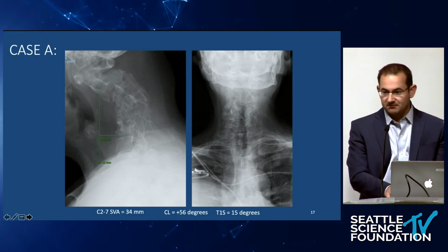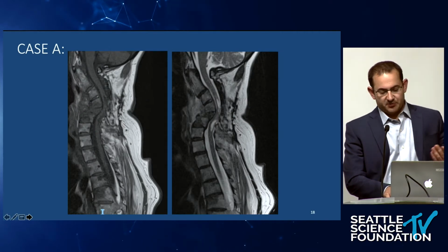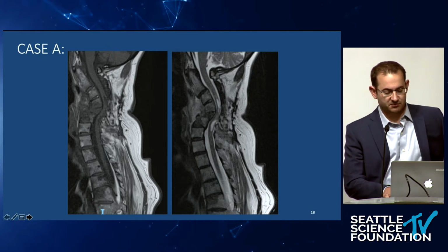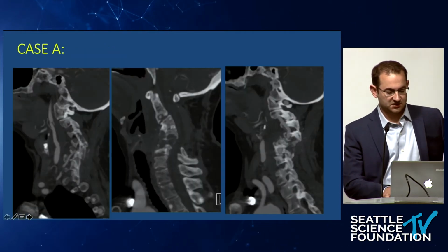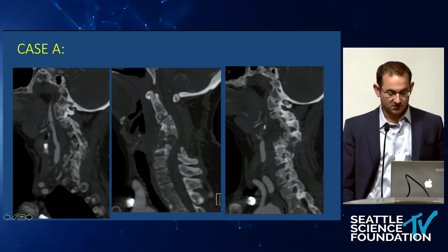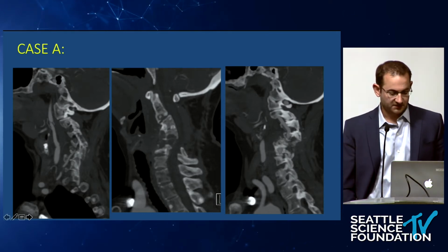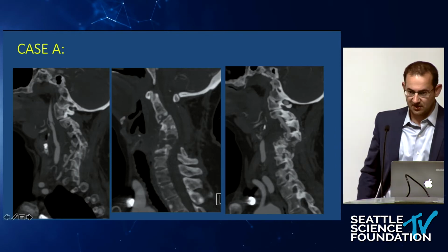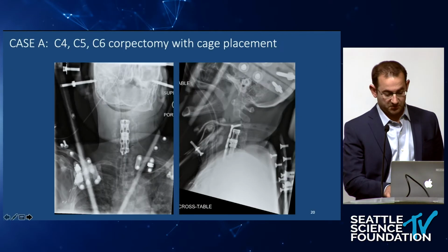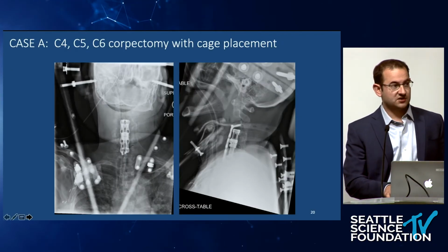So I think there'd be a lot of different opinions on how to treat this. And you can see, I haven't measured, but some flexibility to this when she's lying supine, but clear cord compression and probably chronic myelomalacia and damage. And hard to fully understand what's going on with the posterior elements, but there's some erosion, not complete, not total fusion of the lateral mass. I tend to get CT angiograms for all cervical deformity cases just to assess for aberrancies and for surgical planning. And so I ended up doing this in a staged fashion.